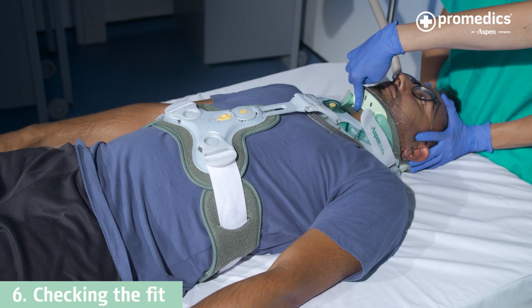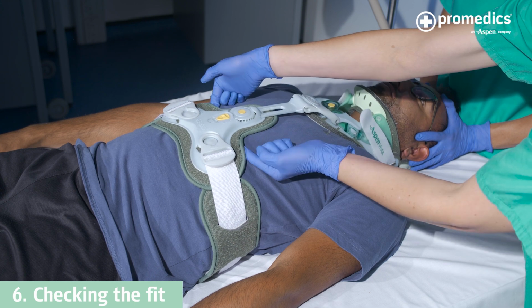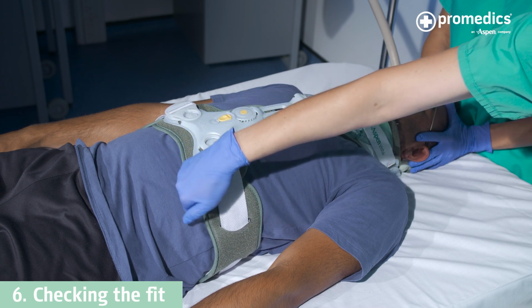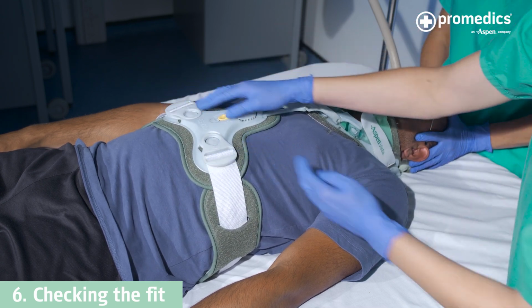Check the back of the chin piece is not pressing into the patient's throat and that they can breathe and swallow. Run your finger around the lower section of the brace and ensure the pads are flush with the skin and all pads overlap plastic components.